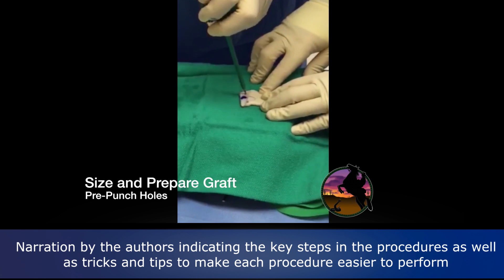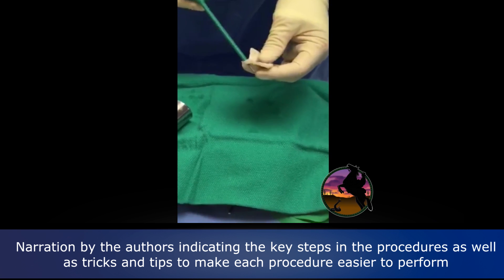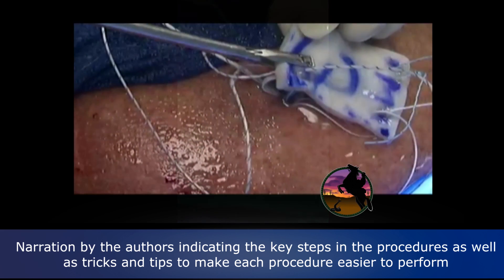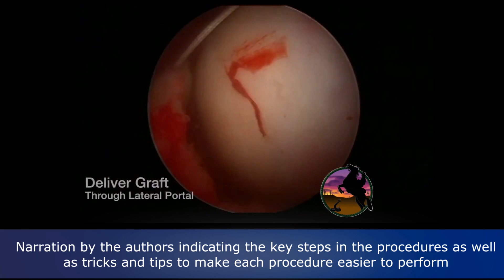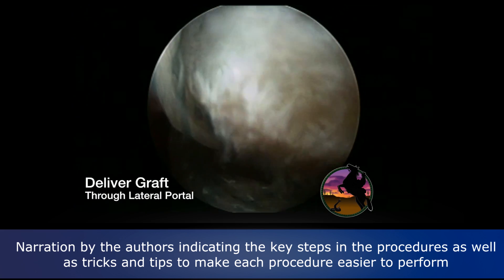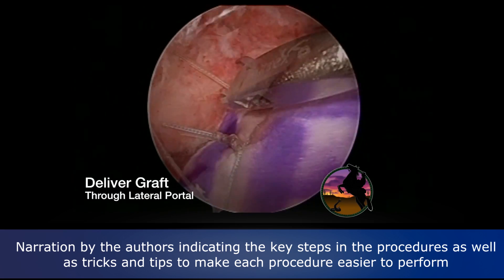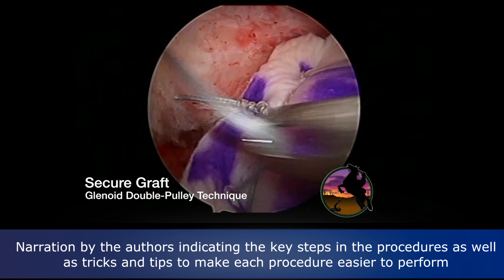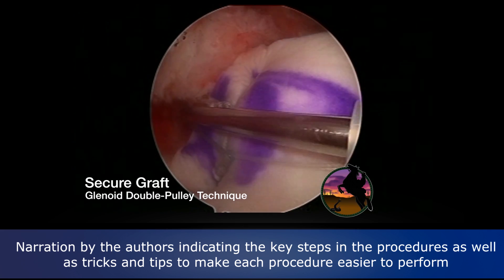Now we're going to make a couple of punch holes in the graft for our lateral anchors in the humerus, and the sutures will come through that. For the more medial anchors we're going to pass the sutures individually. We'll deliver the graft through this lateral portal using a pulley system, then do a double pulley to create a double mattress suture medially.